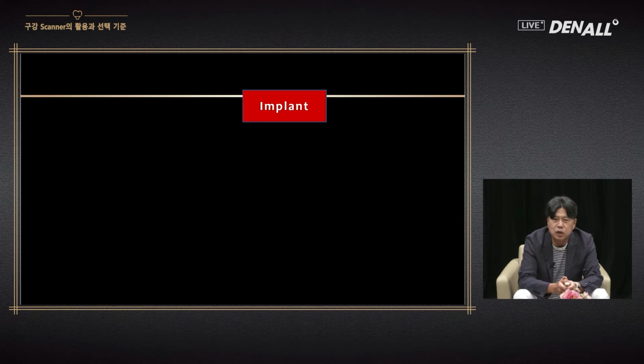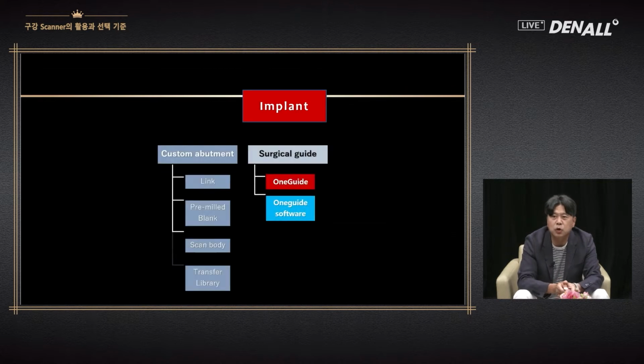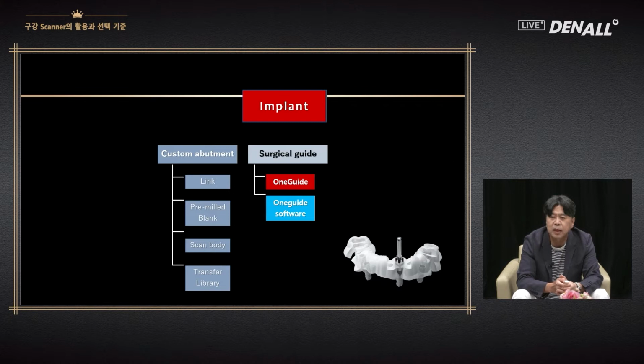So a splint can be fabricated rather easily. The intraoral scanner can be utilized most efficiently compared to the analog approach. It would be the implant area. To digitalize the implant, an intraoral scanner is a must.